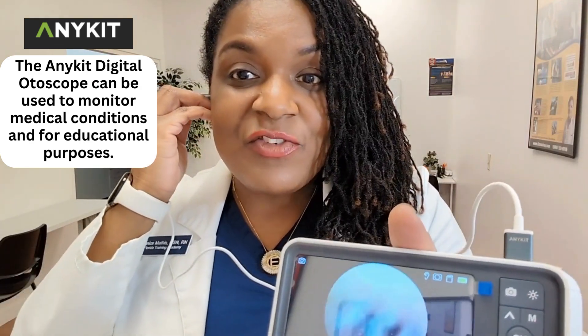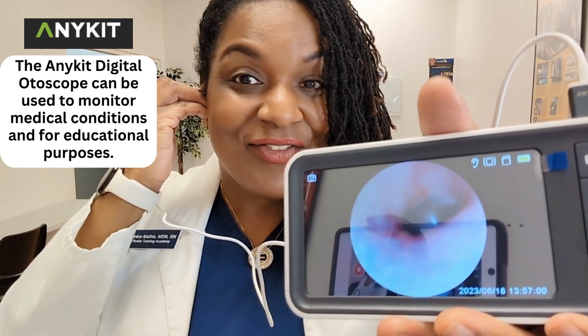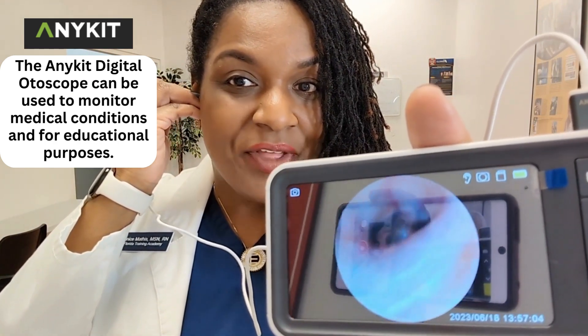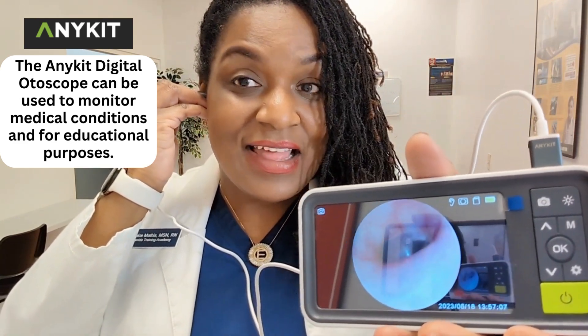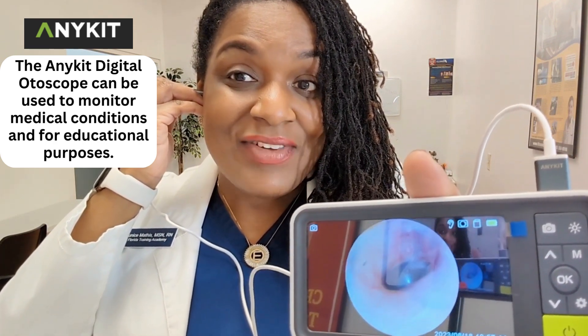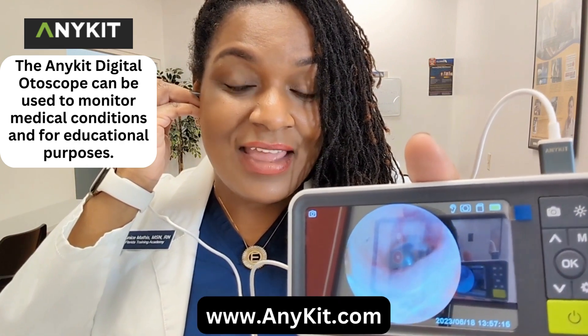Imagine how much value this would bring in the classroom. If you're the nurse educator, if you're the one conducting a health and safety class, and you brought this into the class — and let's say it was somebody who had a unique ear condition — you can even take a picture of it.